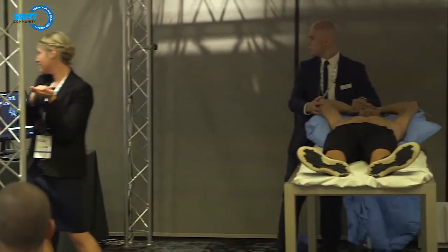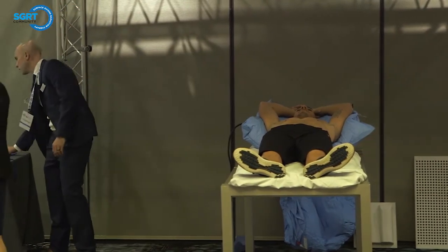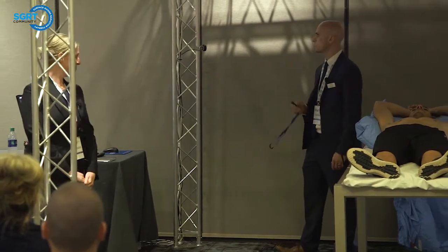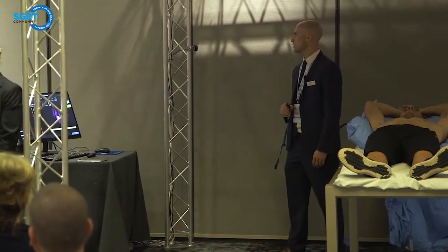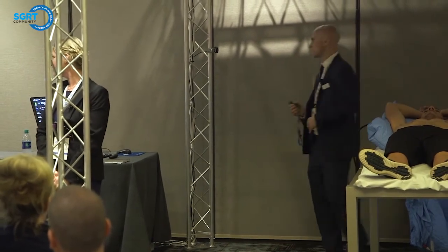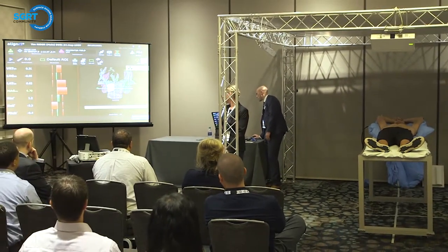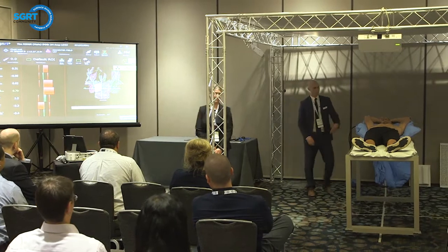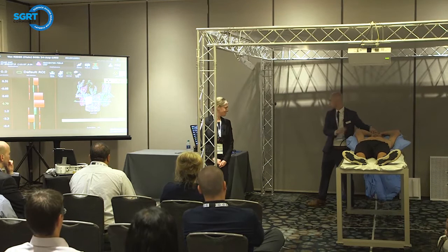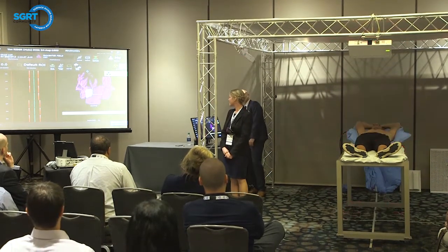So I'm going to look at that image and just try and move his elbow a little bit more in and see if we can make that any better. We also have the remote control, so I'm not tied to the workstation if I wanted to use that. I could take a treatment capture here and then move the arm as necessary and take as many treatment captures as I would like. Okay? So his arm looks pretty close there. Maybe I can come back in just a little bit more. Then we could take another treatment capture and so on.